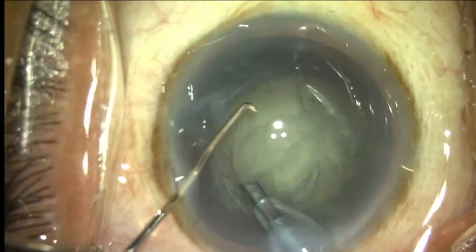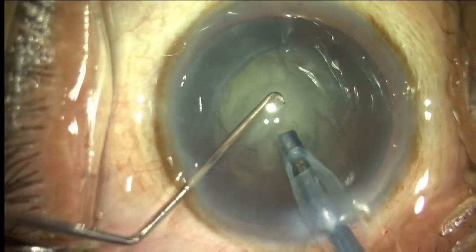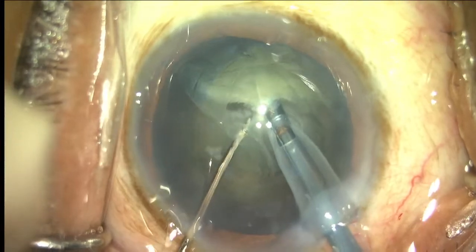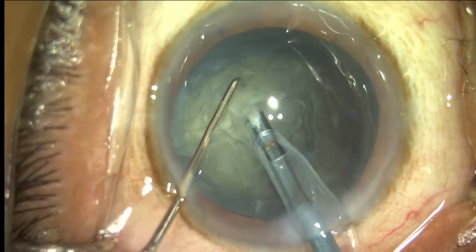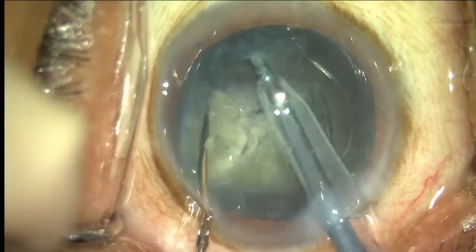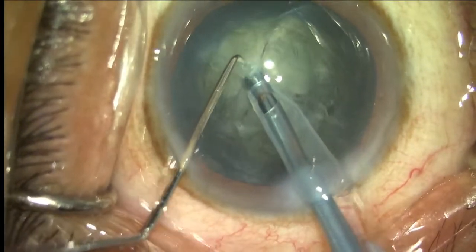So I like to aspirate the superficial cortex that improves my visibility. My phaco power is 40, vacuum is 500, and aspiration is 42. That's the direct chop. And I've divided the nucleus into two halves, two heminuclei. And since it doesn't look like a very hard cataract, I'll just make 4 quadrants. For harder grades of cataracts, I like to make at least 6 or sometimes 8 pieces as well.